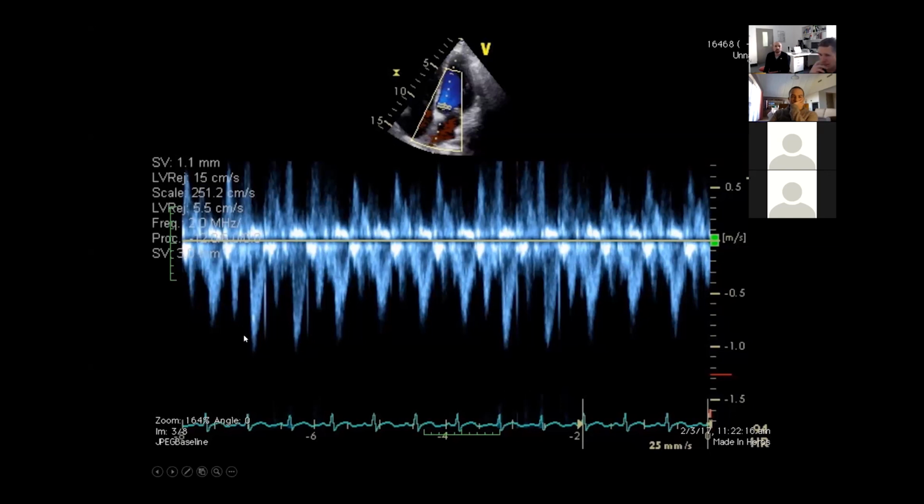So yeah, I do it exactly the same way, and I probably don't do it enough. There's another reason why I don't do it a lot, and that's because I find that it's tricky. On this view here, this is someone who actually doesn't have any respiratory variation. What this person does have, though, is the person doing the scan having an unsteady hand.